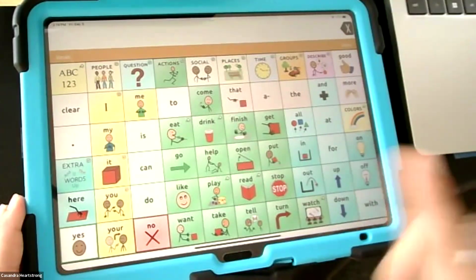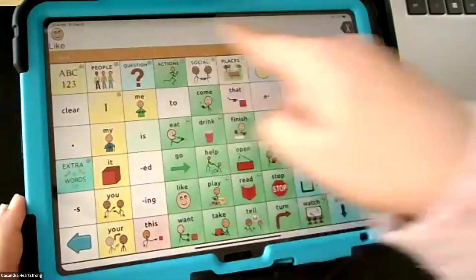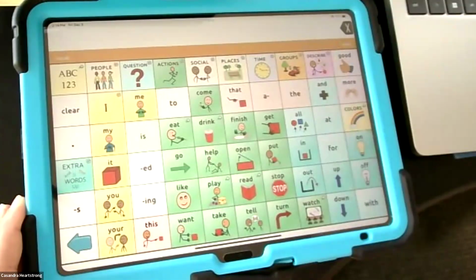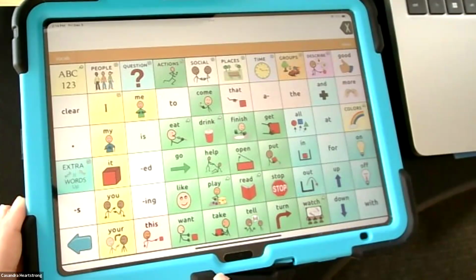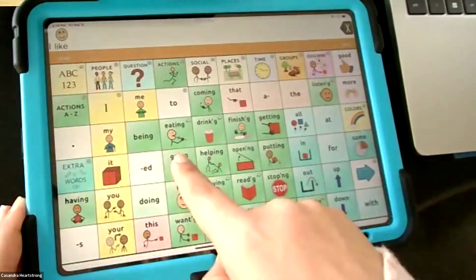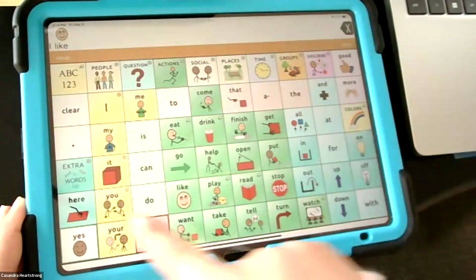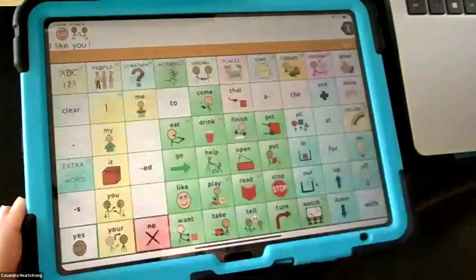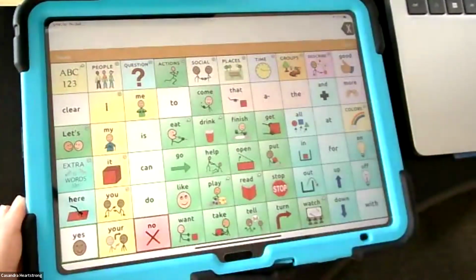You can change the settings so when you touch it, like, it doesn't say anything out loud. It just builds your utterance up here. So the tap to speak, they also all have a delete and clear function. So delete. I, like, going, oops, I meant you. I'm going to delete. You. And then I can also clear, and the whole thing goes away.